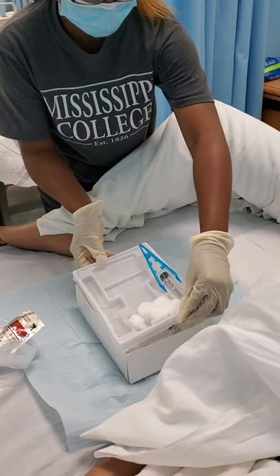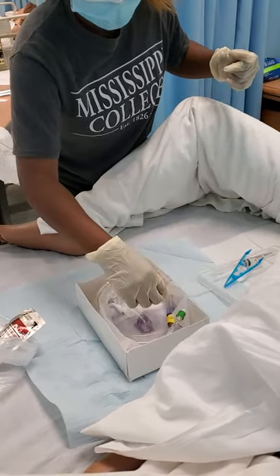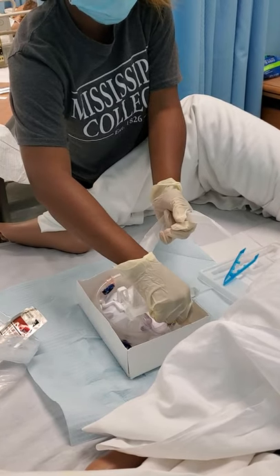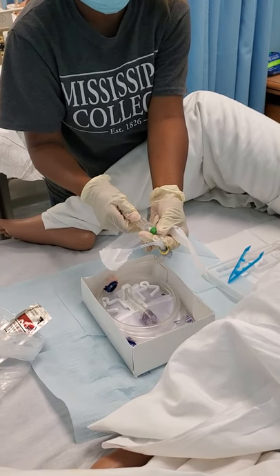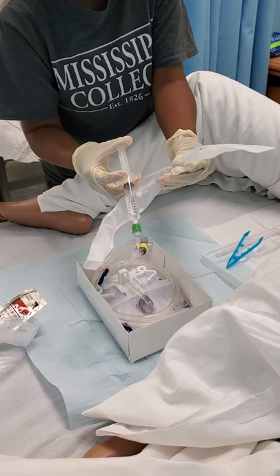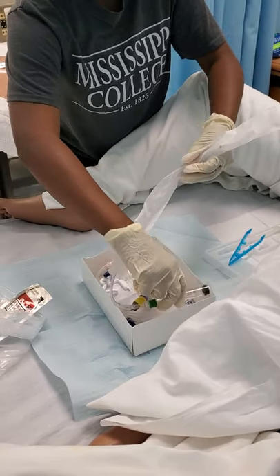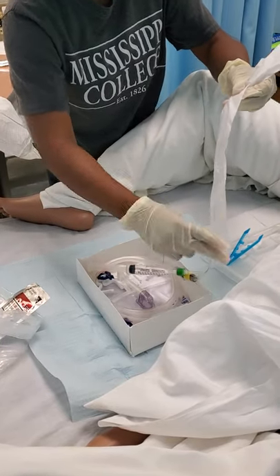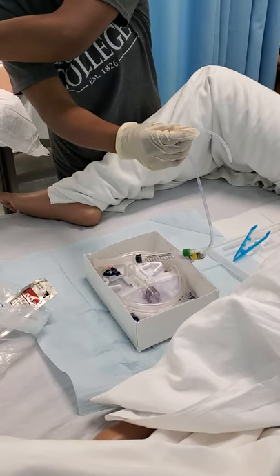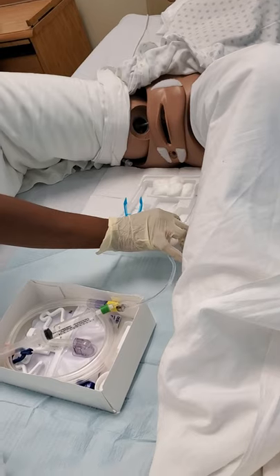All right. So now I'm going to inflate the balloon to see if the catheter balloon is intact. And it is intact. Okay. Now I'm going to remove this cover. And I'm going to discard that over there. Okay, now I'm going to put the catheter into the lube. Make sure it's lubricated at least 2 to 4 inches.